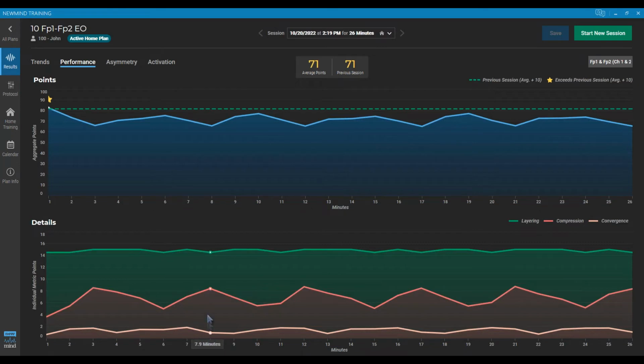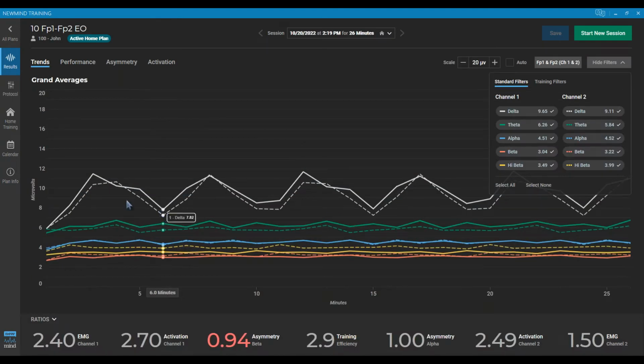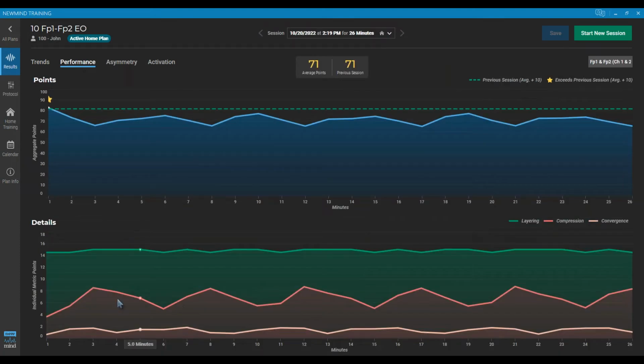Now you can see here, let's just say this is at the 8-minute mark, we see their compression came up, where we want it down here, like where it was at the 6, or actually really want it down here. But we can see that if we go back and look at the trend lines at the 6-minute mark and at the 8-minute mark, well, there's the 6-minute, we have a compression. We've got that slow wave frequency coming down, getting closer to the betas. And then here they cycle back out. And at that 8-minute mark, we see that delta just kind of rising back up. And that's what's affecting the compression here. So this is as the delta and thetas came down, and here's as the delta and thetas came back up and moved down and back up. So they just kind of oscillated through the whole session here.